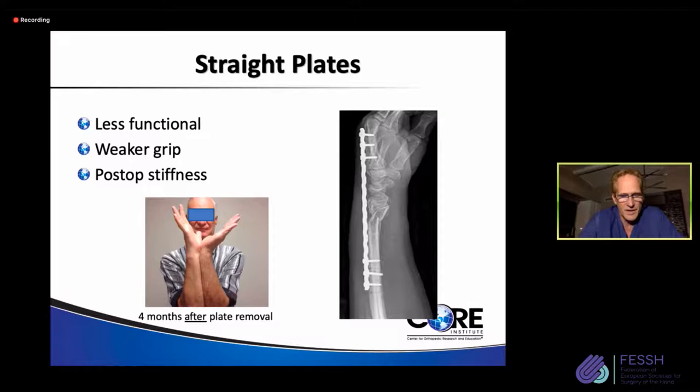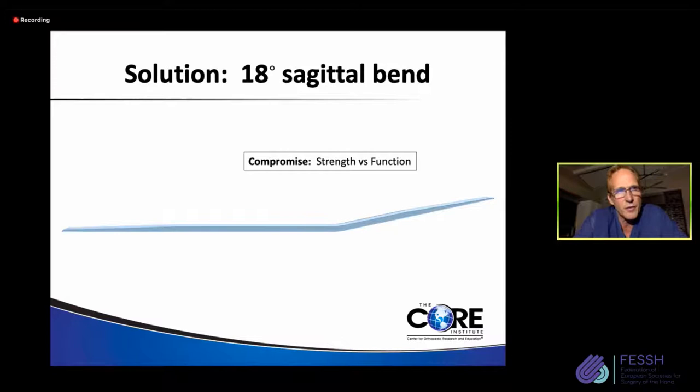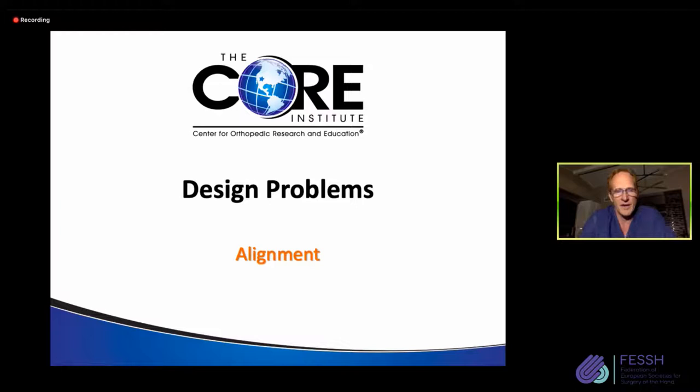So Medartis felt a good compromise because 25 to 45 degrees is a little bit extreme for most people. An 18 degree sagittal bend seems to be a good compromise between strength, function, cosmetic appeal, and patient satisfaction. So that's what their two plates are designed to be. Now, the second problem is even more interesting. This is an alignment problem.